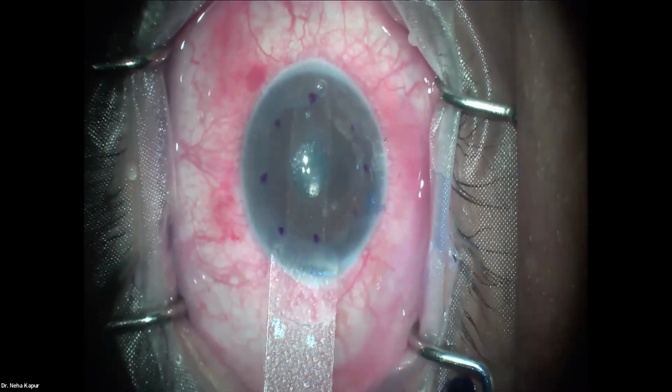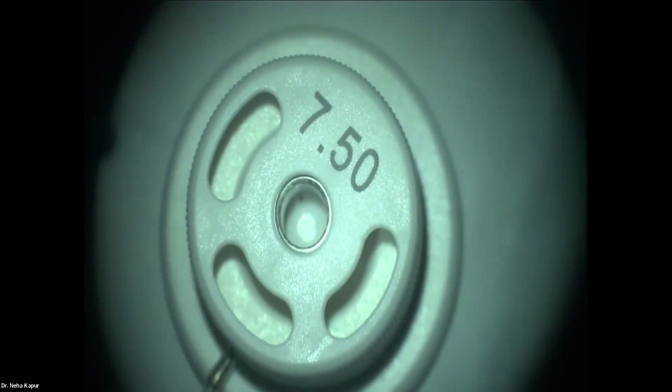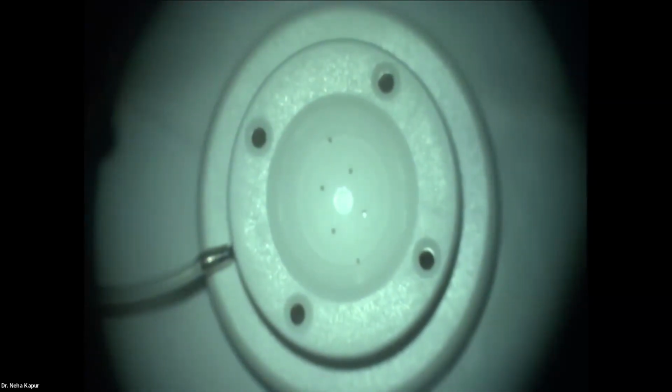We'll go and dissect the lenticule now. So I'm shifting the view to the lenticule dissection. Like we decided on a 7.5 mm lenticule, we will now dissect the lenticule. And this ideally should be done under the microscope only. We have a pre-cut tissue ready here.